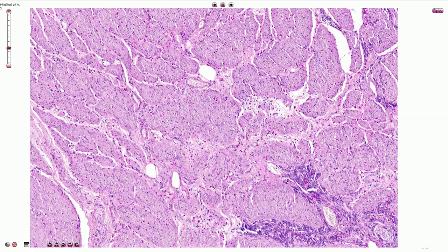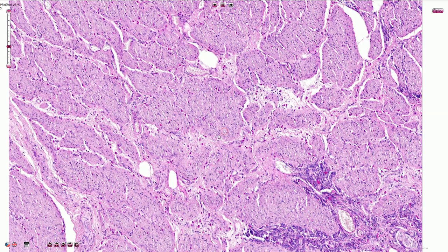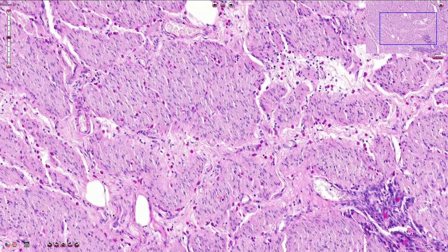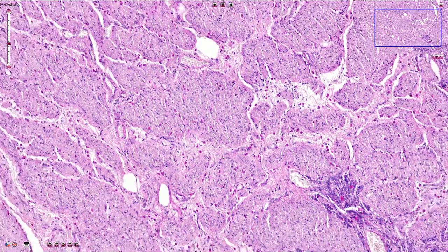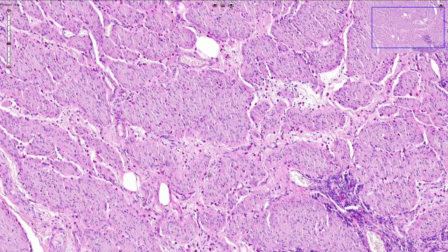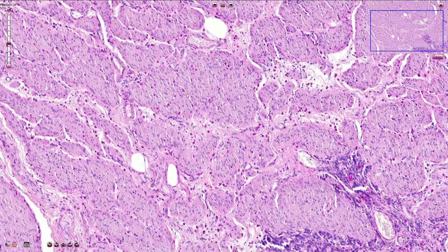This is another case stained by PAS stain. All these malignant cells are clearly visible with PAS-positive mucin content in their cytoplasm, and we can see that they infiltrate the lamina muscularis propria.